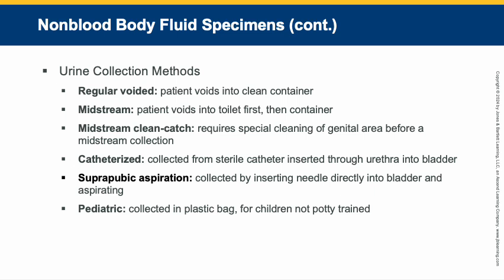But in this case, you're going to be a little extra careful. You're going to take a special little cleaning wipe, and you're going to wipe the genital area before the specimen is collected. And then this is going to ensure that there is nothing in that area that is going to get into the cup. So a phlebotomist must be able to explain that procedure to both men and women in the collecting methods.